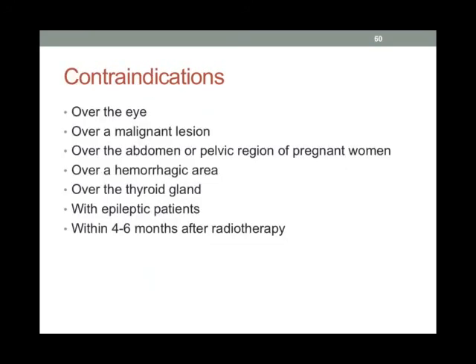All right. So the contraindications are not exactly the same as for ultrasound or for electrotherapy. Certainly there are areas that you don't want to put light energy or laser energy into. Any area that's hemorrhagic, you don't want to use it with epileptic patients, or within 4 to 6 months after radiotherapy. Radiotherapy is when people are getting large amounts of radiation in order to treat a cancer, so they have a lot of buildup of radiation within their body. So within 4 to 6 months after radiotherapy, you would choose something other than laser.